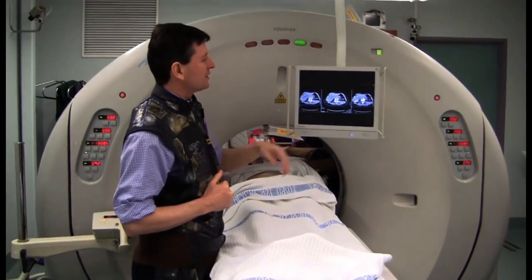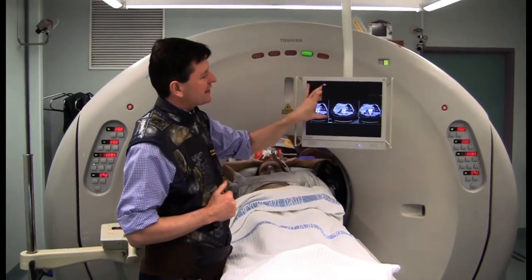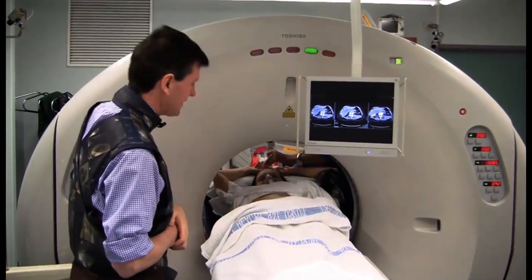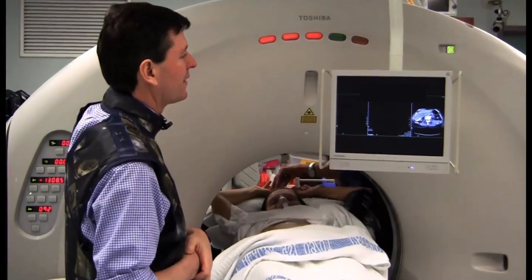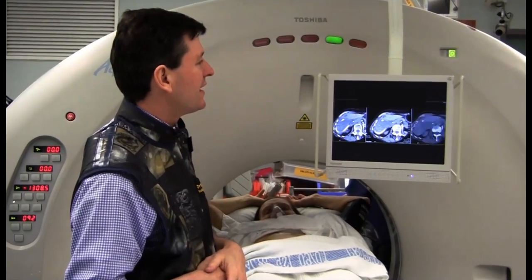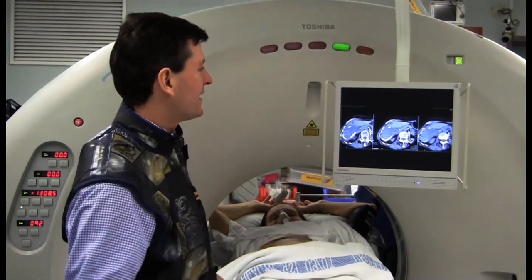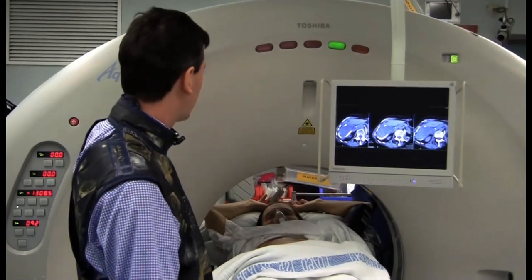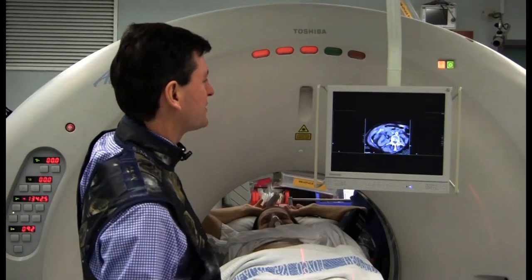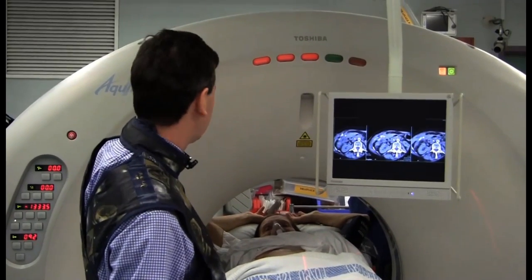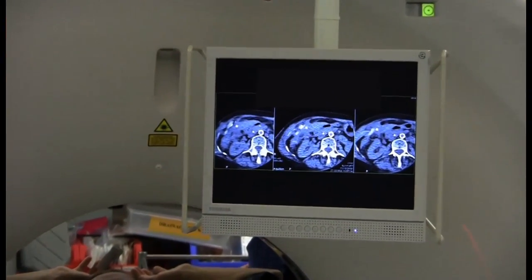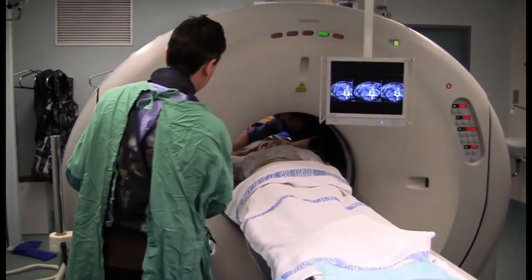We've just got the patient in position. A single-shot tap of the pedal shows this position — we've raised the patient up so she's nicely in the middle of the gantry. This is where our collection is. We've organised some zoom, and tapping the pedal again will show the level of zoom. We're running 40mA, 4mm slice thickness — that's probably a good set of numbers. Just free-float the table top down a little bit, have a think about exactly where we're going to go in and where the laser cuts achieve that.